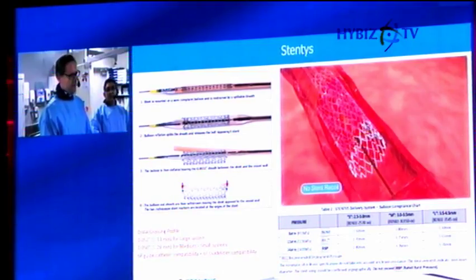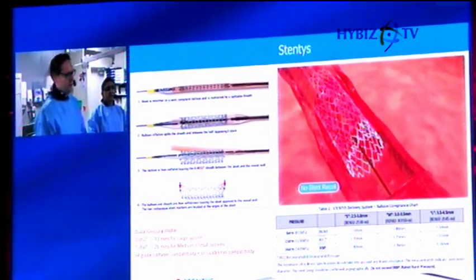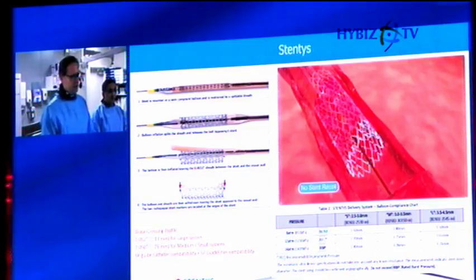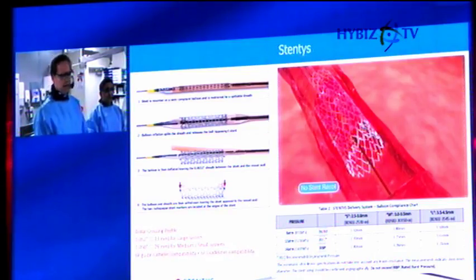And we felt that given the anatomy of this vessel, getting a good result with conventional technology would be very difficult. So we're now going to move on to the case. We've taken a couple of setup shots, including some OCT using our 3D co-registration system. So we could go now onto the OCT pictures, please. Go onto the OCT feed.